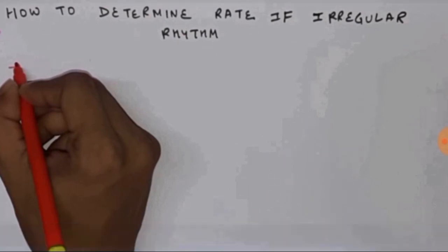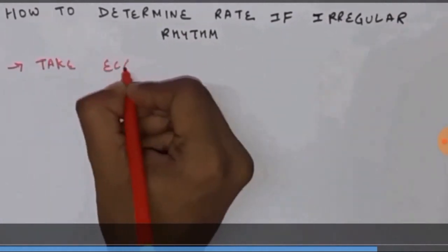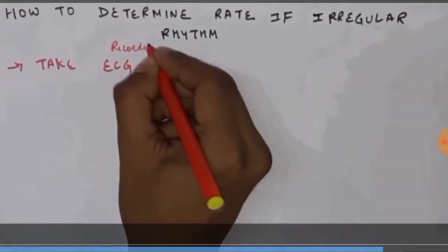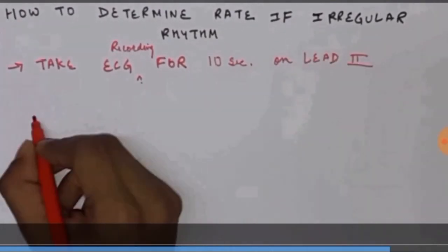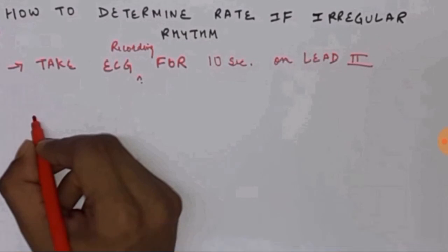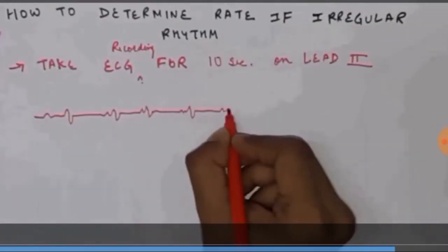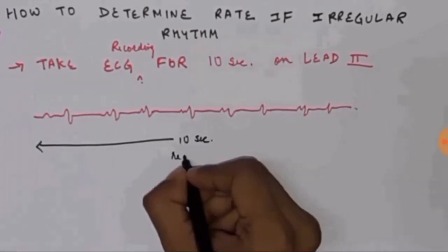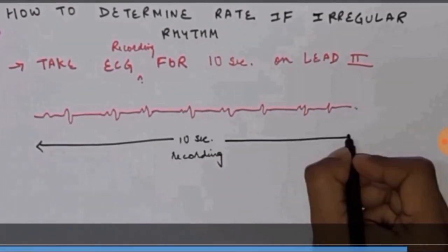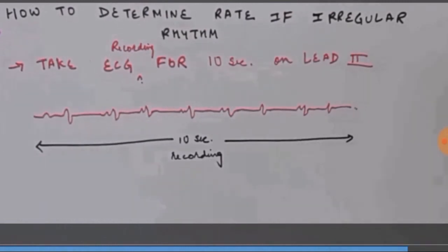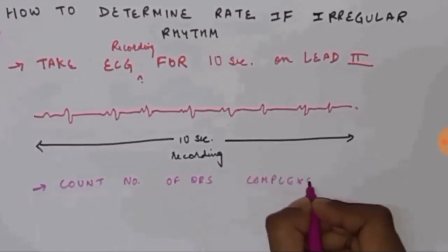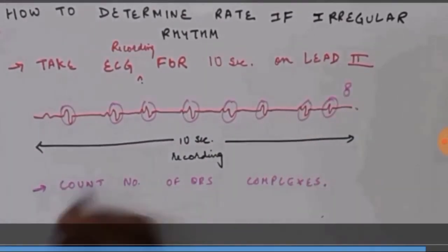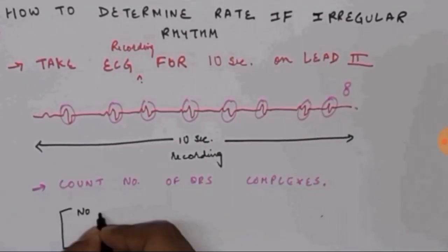How to determine the rate if it is irregular rhythm? Let's going to see. Take the ECG recording for 10 seconds on lead 2. What does that mean? We are going to turn on the ECG machine, and we are going to wait for 10 seconds, so that it makes a recording like this. This is a 10 second recording, and we are going to calculate how many number of QRS complexes are there in a 10 second recording. Here, it is 8. So 8 is the number of QRS complexes for a 10 second recording.